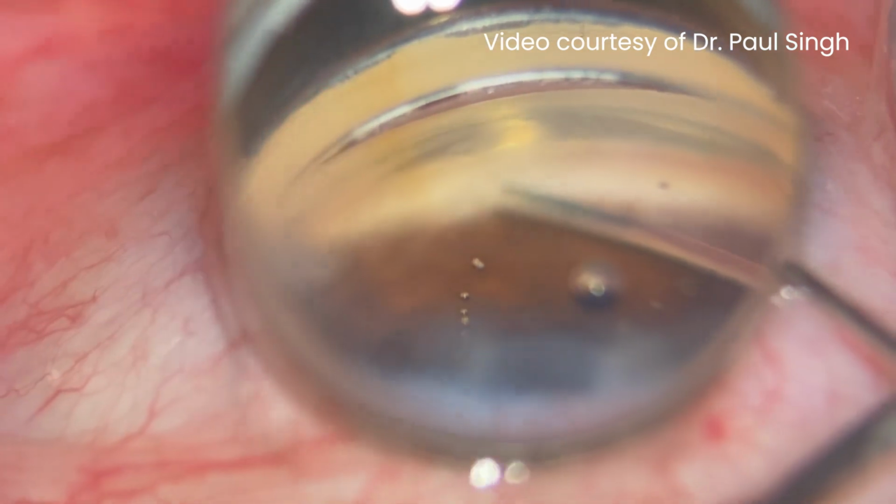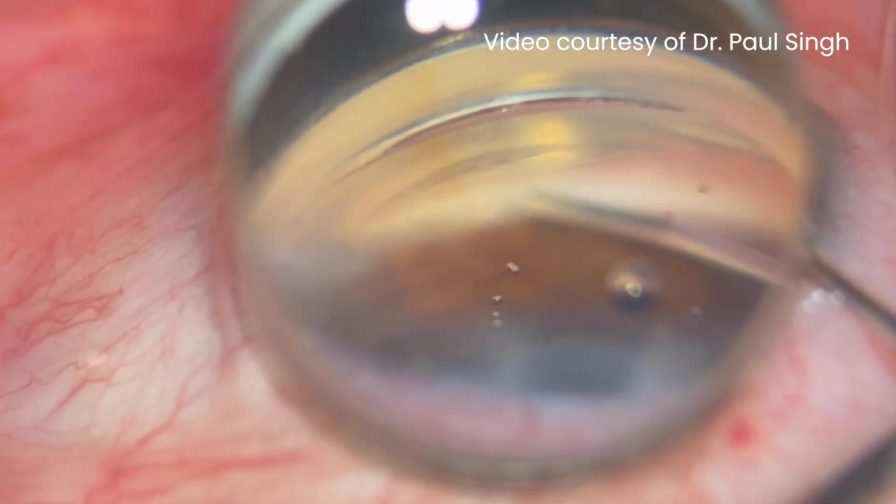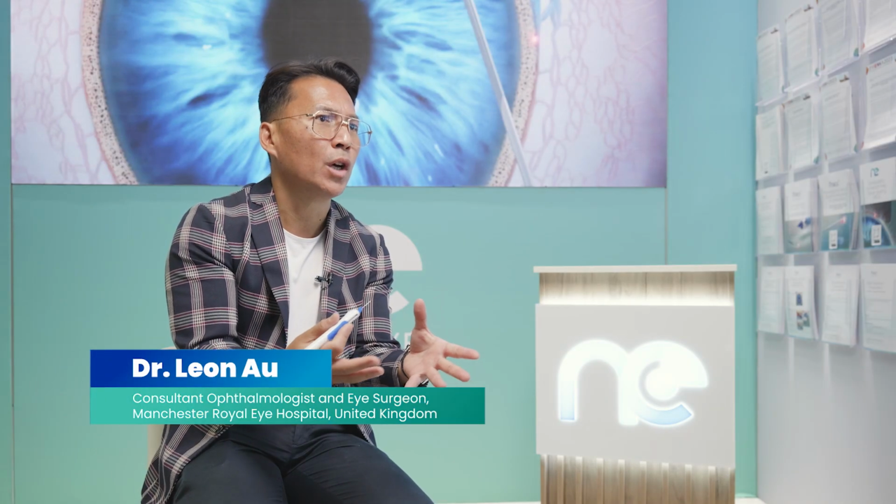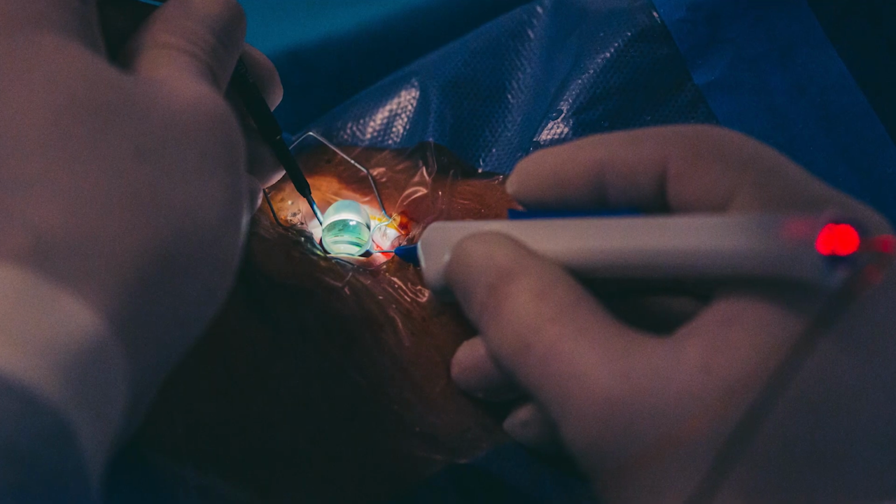Number two is that intraoperatively, making sure that you have a good view. So surgically, get yourself comfortable with the amount of viscoelastic in the eye, how much head and scope to tilt, and how much pressure on the gonio prism. In any MIGS, the visualization, the positioning of the patient on the microscope is crucial to have a good view of the angle. The visualization is always most important during the surgery, so get your gonioscopy correct so you get a really good view. My biggest tip is always increase your microscope light, because you lose light with gonioscopy.